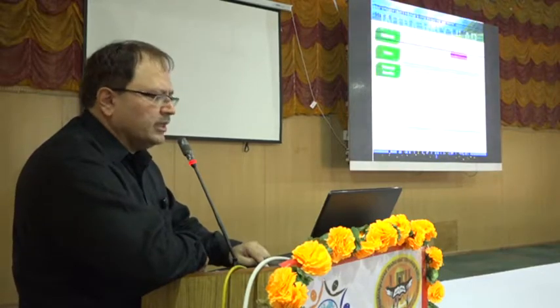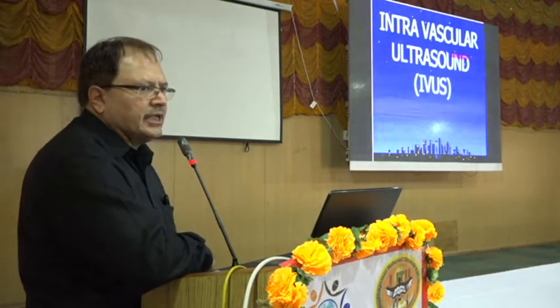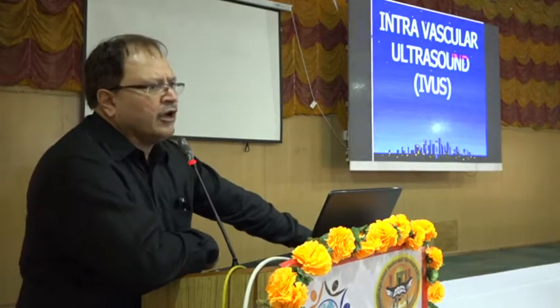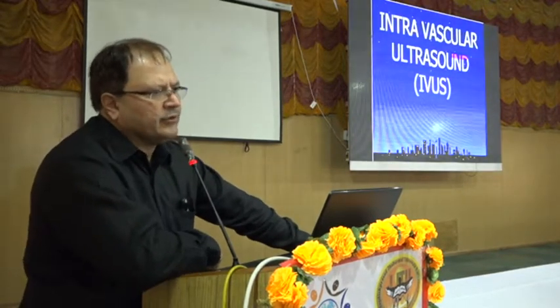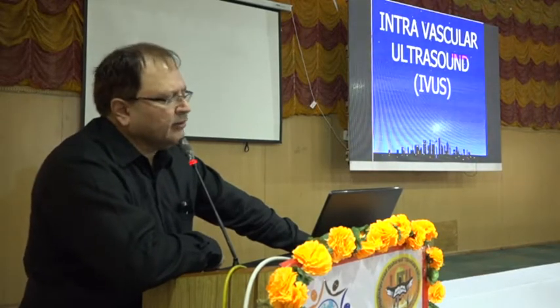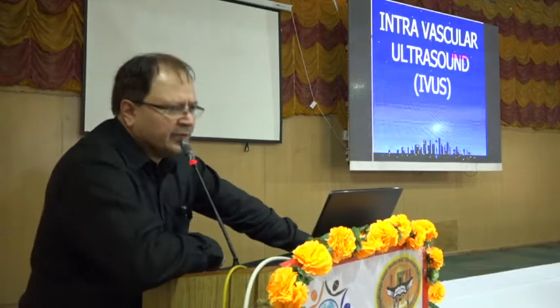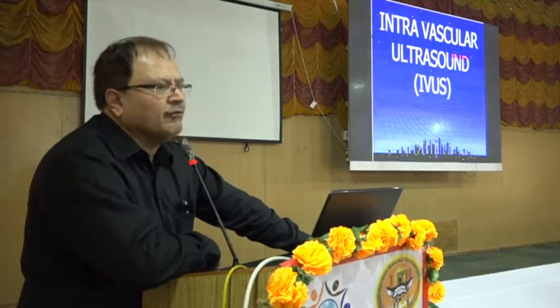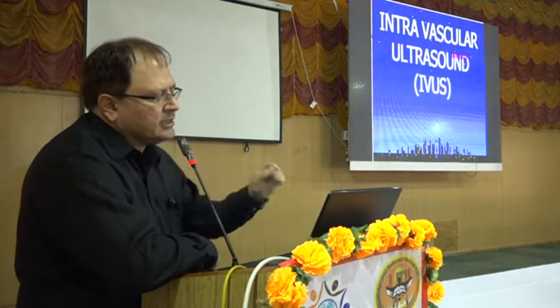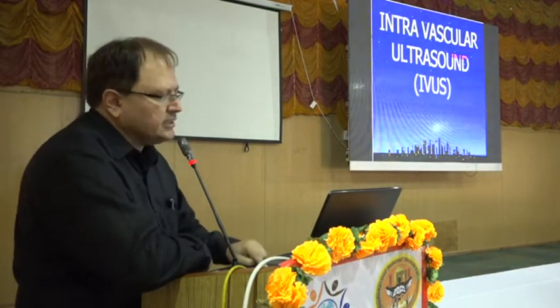Well, what is new in the imaging, particularly now the imaging of cardiology? This has grown enormously in all its dimensions, particularly in the western part. They are doing almost all angioplasty under imaging. What are these imaging modalities? The number one imaging is the IVUS, that is the intravascular ultrasound. What we do is we put an ultrasound. What is the IVUS?